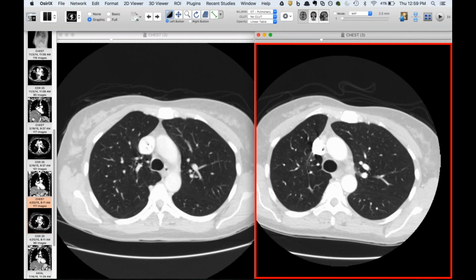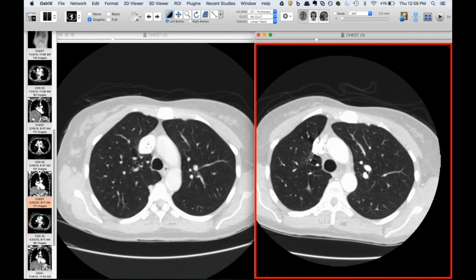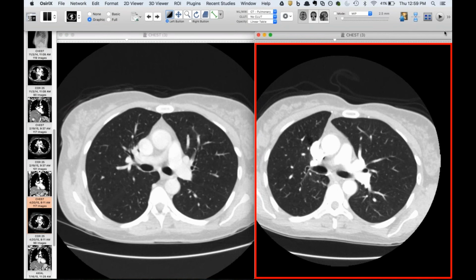That's cool. I had never seen that until you showed a case of this a couple years ago. I know, it's funny. I remember seeing one and wondering how many times I'd missed it going back, because I've subsequently seen a few cases of it, and there are case reports of it. But I think the Yellow Journal paper described it nicely and showed that it either went to where yours went, Travis, or where Howard's went, where it kind of just hangs out adjacent to the lung apex. It doesn't move all the way. And I think I have a few more cases of it. We had one post-trauma, I had one post-esophagectomy, and I think another post-lobectomy or spontaneous pneumothorax.